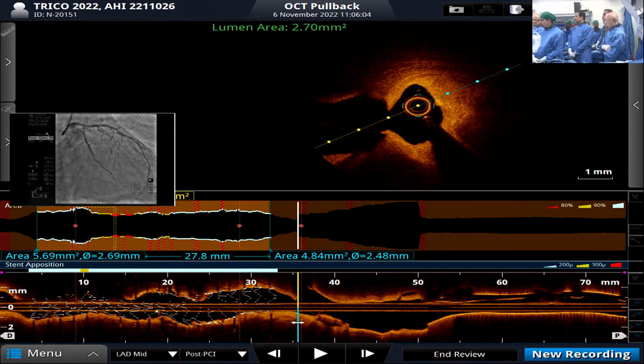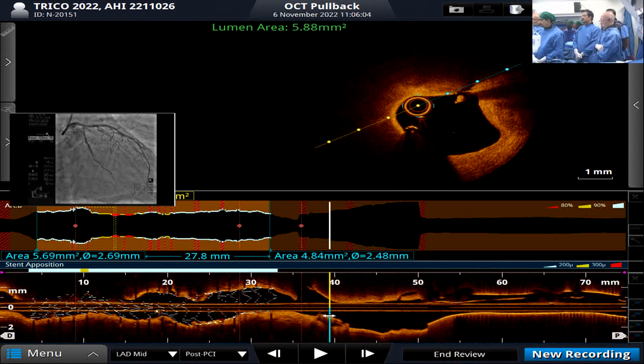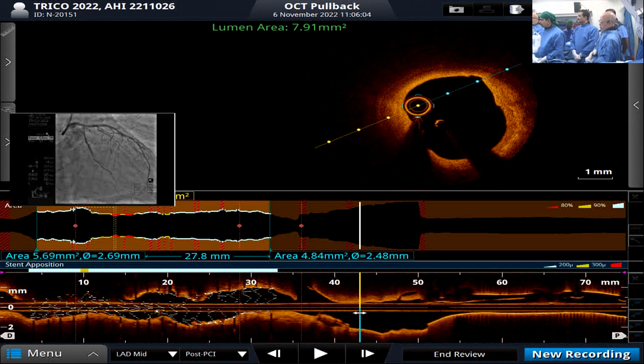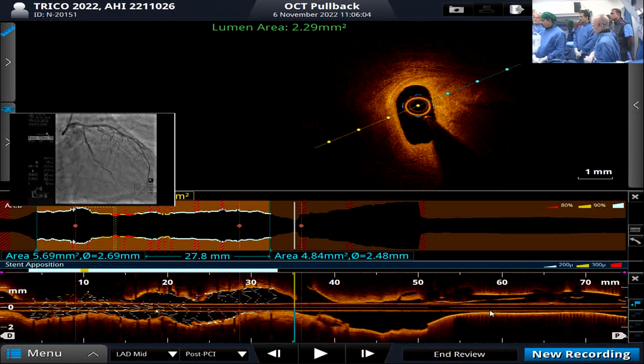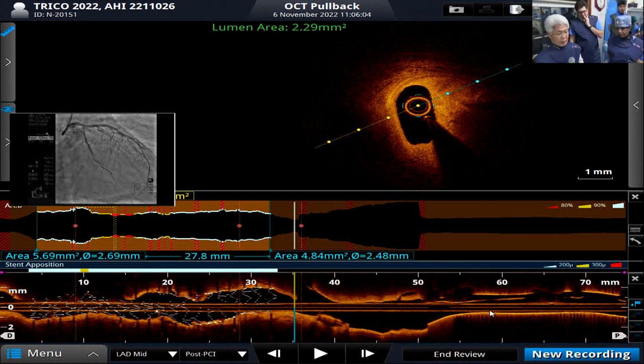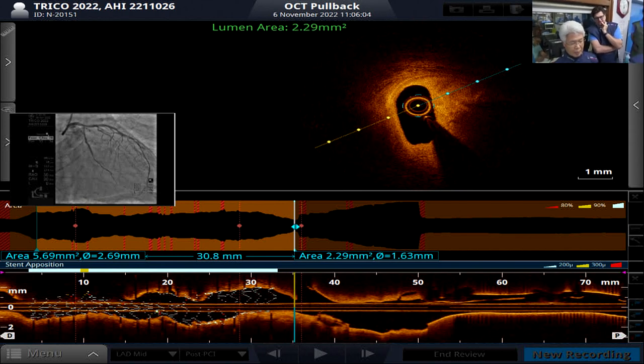And there is protruding calcium, but that in and of itself should not limit stent expansion because it's so focal. Yes, I agree. Now the question is, should you stent for that or not? This is the discussion we were having earlier. There are good imaging cutoffs on IVUS to tell you that you can defer, but there isn't a ton to tell you that you should stent. And this is where perhaps a physiologic approach might give us some information.